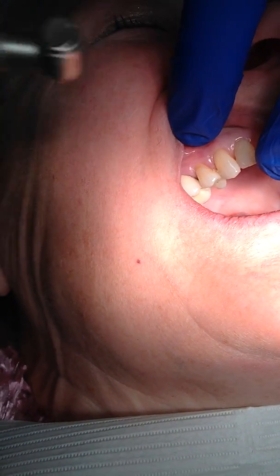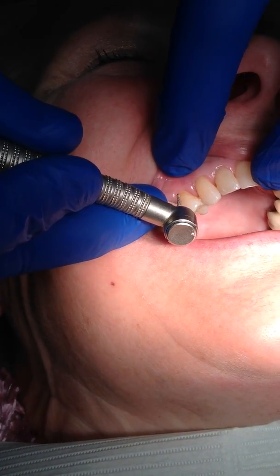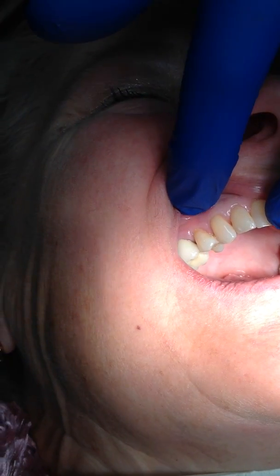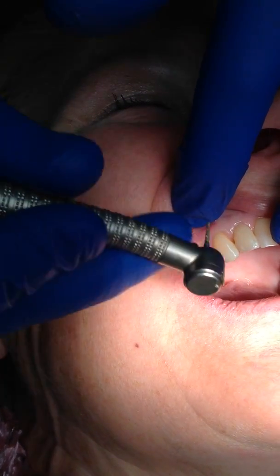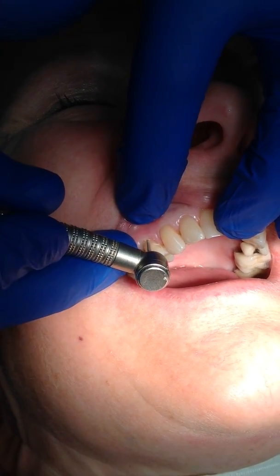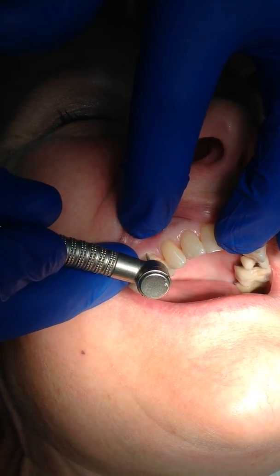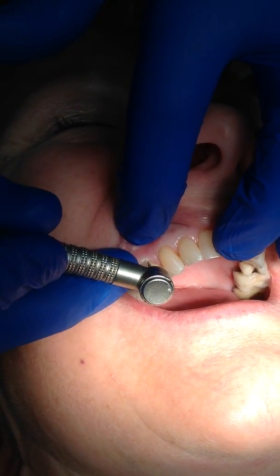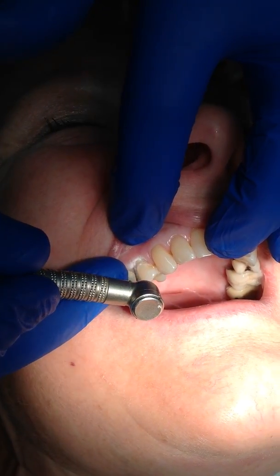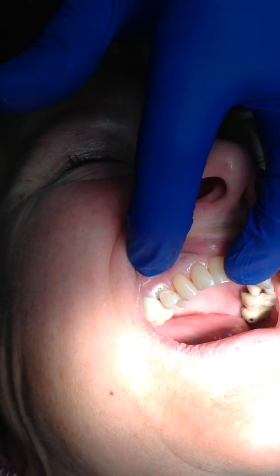Now the preparation for these teeth is extremely easy. All we really do is go in and roughen up the dentin. And then we create a long bevel on the facial surface. So that's the prep.